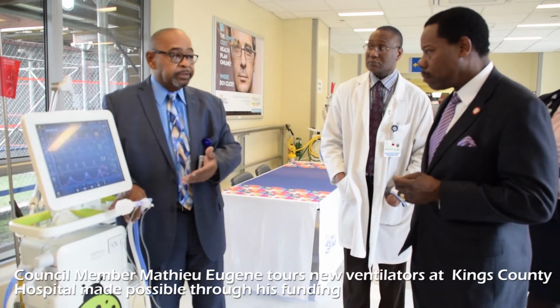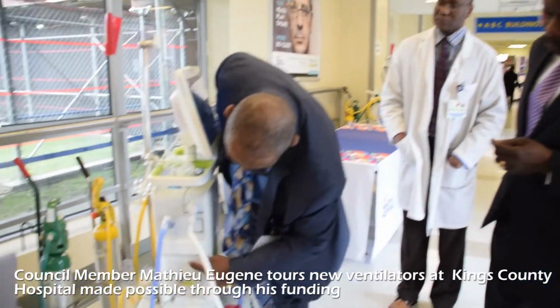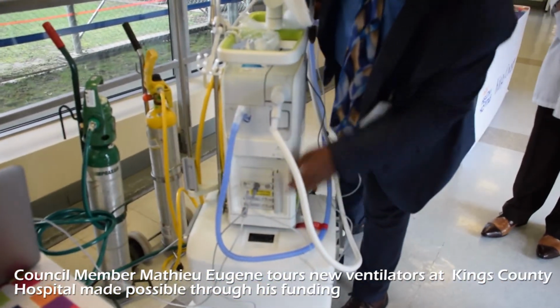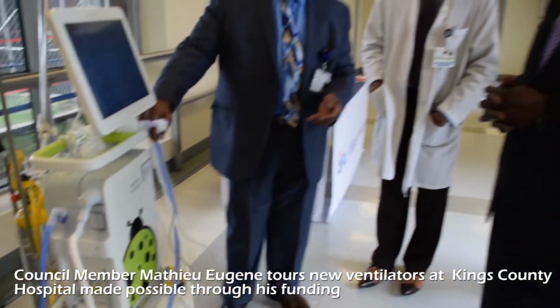Because we have other things in these bays. You call this the plug-and-play section. Those are the batteries. That's the simulator, and that's for the proximal sensor. That makes it much easier for the baby to trigger the vent.